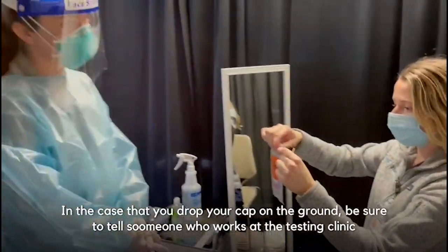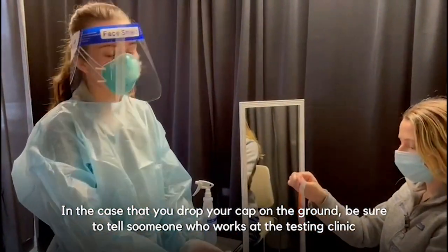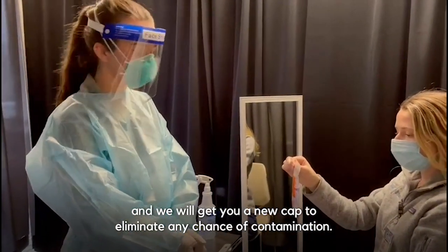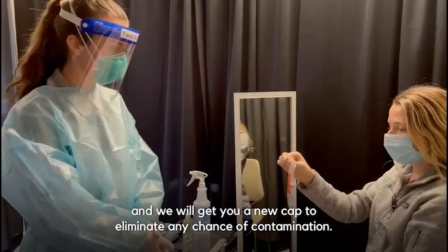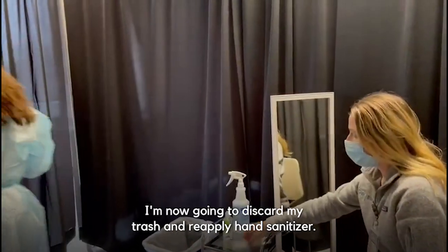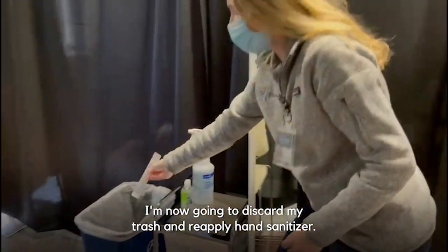I'm going to now place the cap on the tube and place the sample into my biohazard bag. In the case that you dropped your cap on the ground, be sure to tell someone who works at the testing clinic, and we will get you a new cap to eliminate any chance of contamination. My sample is now ready. I'm now going to discard my trash and reapply hand sanitizer.